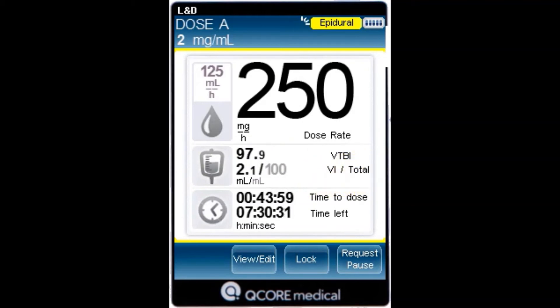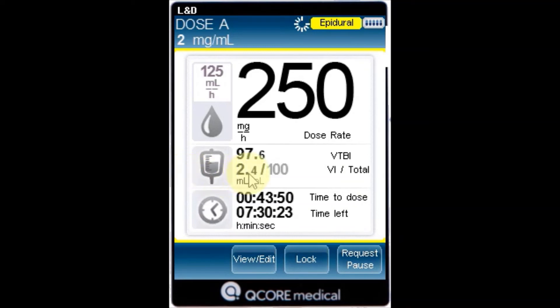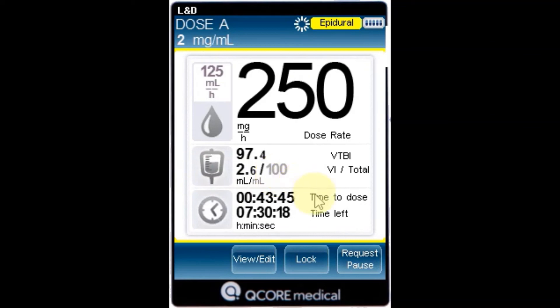VI over total: the total volume delivered in the current infusion, including KVO if applied during a delayed start period, over the total VTBI value programmed. As the infusion progresses, the VI increases and the total remains constant.